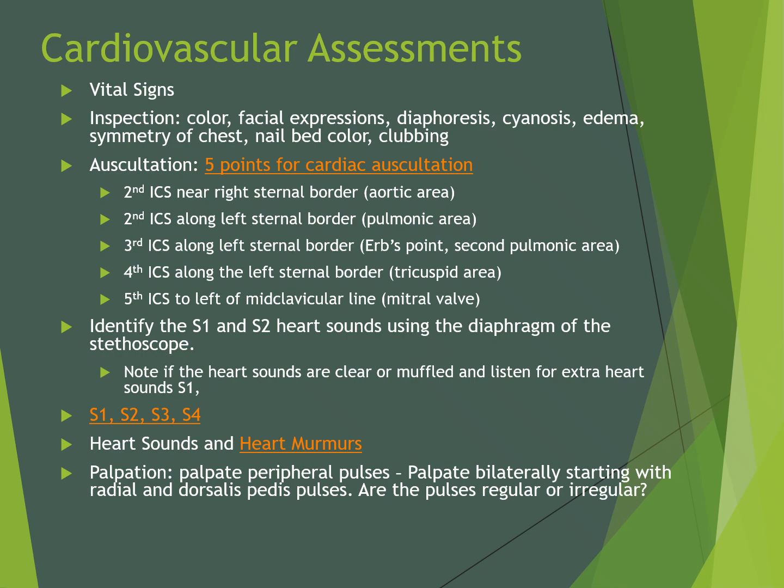This slide provides a brief overview of a thorough cardiovascular assessment. Historically, on the medical palliative unit, we are doing system assessments based on what the patient's admitting diagnosis is. In our satellite telemetry monitored patients, we want to ensure that we are focusing on the cardiac system and providing the patient with a thorough cardiovascular assessment.